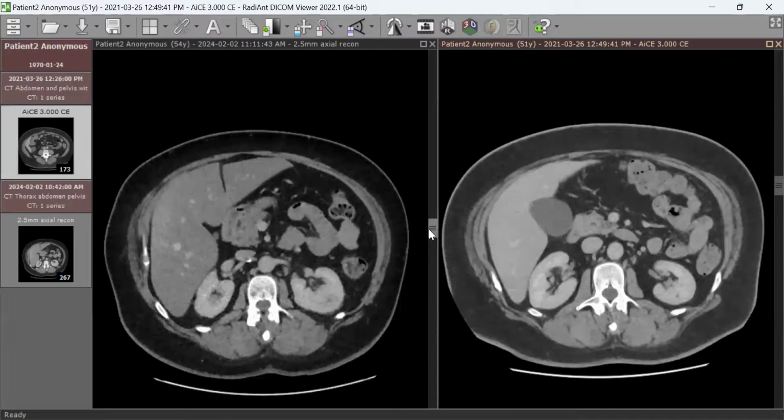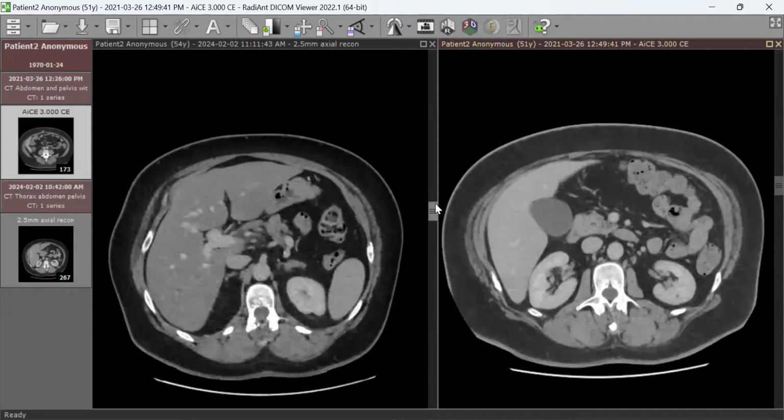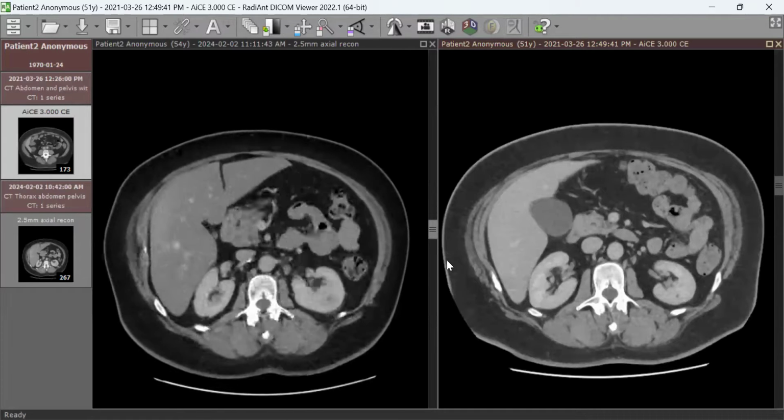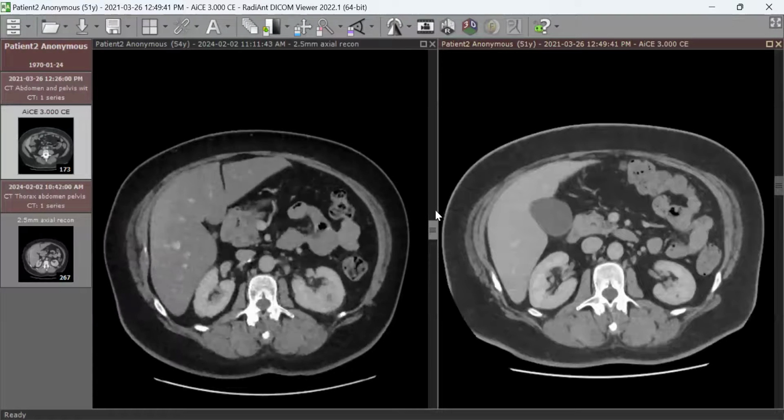In my recommendation, you mention the lesion, you mention the other findings, and lesion suspicious for RCC in the left kidney, provisional staging, you mention that. I recommend for management. No, what do you refer to the patient?